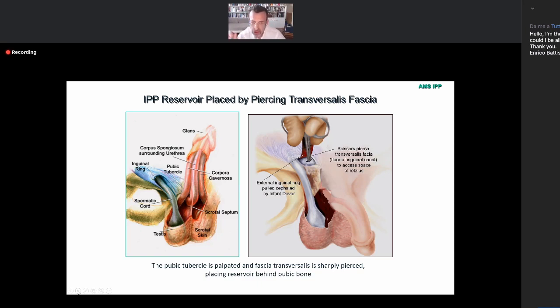Don't go to the lateral side because there are the iliac vessels, and also don't go completely medial because there is the bladder. Go to the medium aspect, going probably mainly toward the contralateral shoulder of the patient. This is a direction that you can take the scissor, and usually there is no problem doing things like this. Go ahead with the next slide.